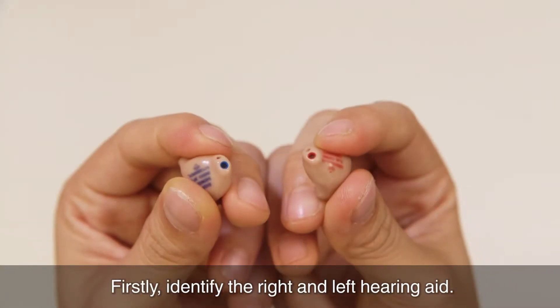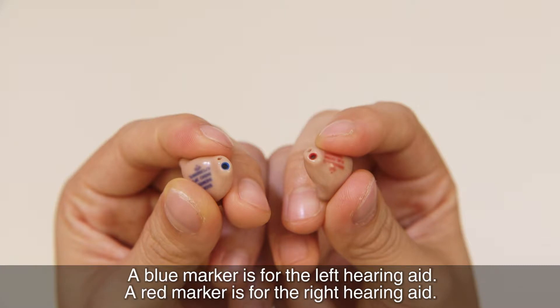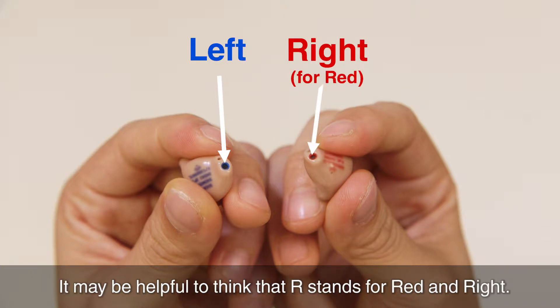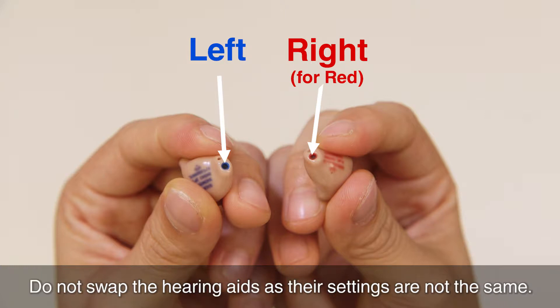Firstly, identify the right and left hearing aid. A blue marker is for the left hearing aid. A red marker is for the right hearing aid. It may be helpful to think that R stands for red and right. Do not swap the hearing aids as their settings are not the same.